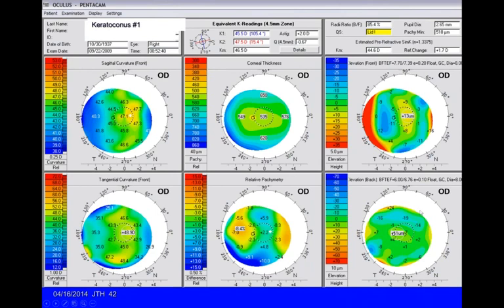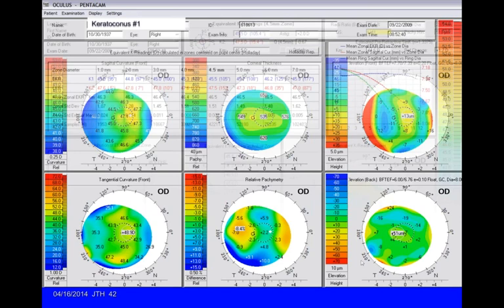The EKR-65 is what I recommend for use on everyone—normal patients, post-LASIK patients, keratoconus patients, anybody. Whether it's a regular or irregular cornea, the EKR-65 will give you the best result. If it's a normal patient with a sharp peak, the EKR-65 and the EKR mean are essentially the same. As they get further apart, the EKR-65 becomes the better value.